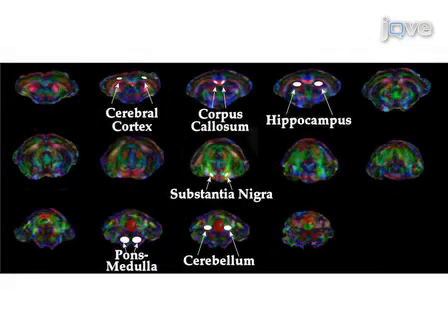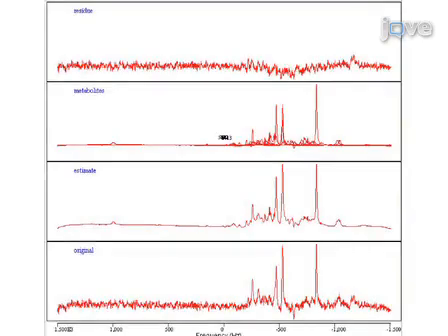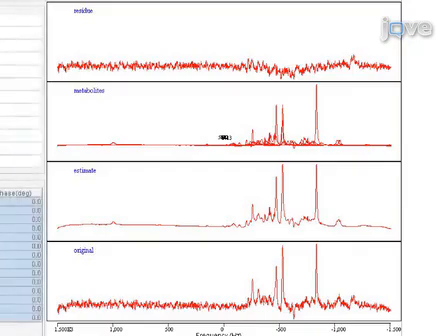Data from each region of interest are downloaded as a text file to be input into a database at a later time. An example MRS curve fit result from a single spectrum is shown here. In our laboratory, we employ a time-domain fitting method called Quest in the JMRUI signal processing package.